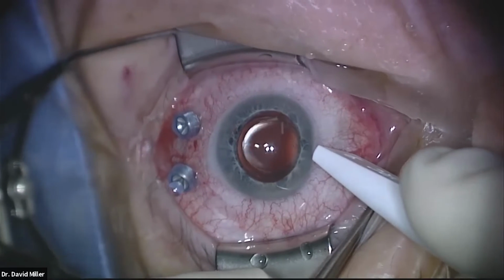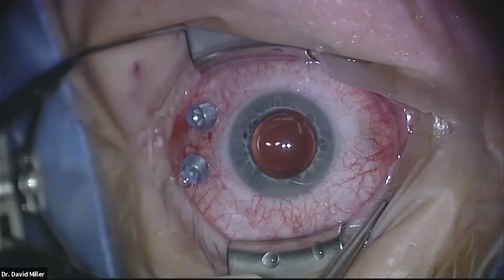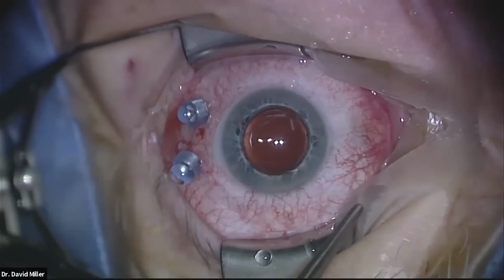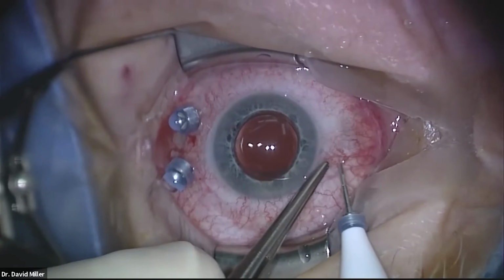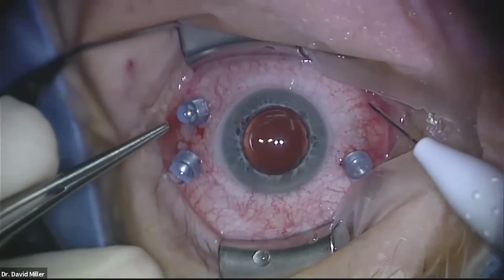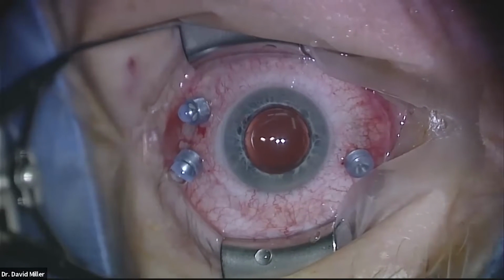Again, with this instrumentation, 25 gauge instrumentation in particular, the instruments are very flexible. And so you don't want to be too high in your site selection because it makes it tough. You have to rotate the eye more. Whereas if I've had the instruments here, I can just pivot to reach the bottom or the back. If I'm down here, I have to drive the eye and the instruments will flex.